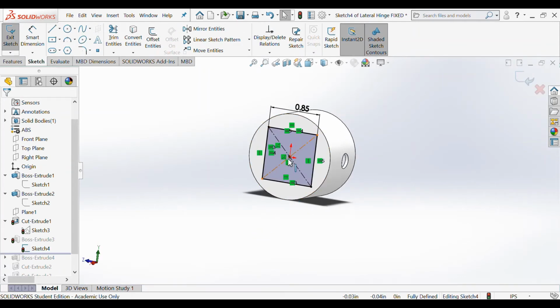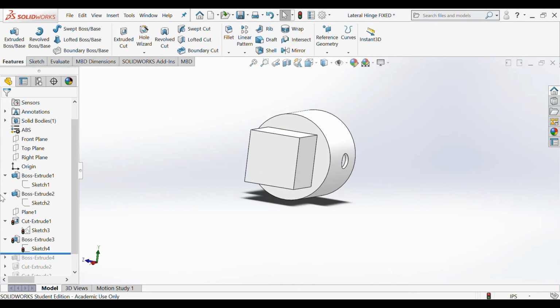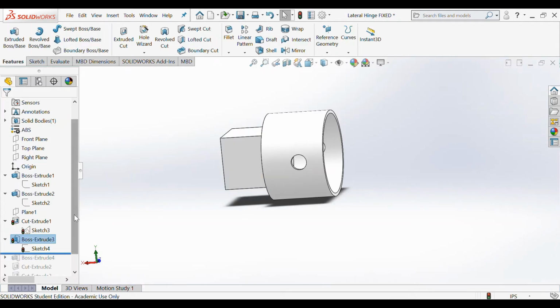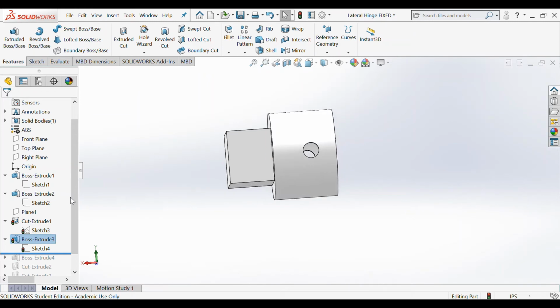So we're going to draw a center rectangle from the origin out, and as you can see, we're going to define these two lines as perpendicular and also to have an equal length, and then we're going to choose this length to be 0.85 inches. After creating that sketch, we're going to boss extrude it backwards blindly to have a depth of 0.7 inches. This gives us about half of our component.